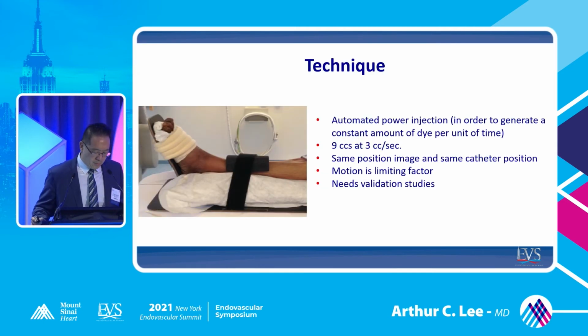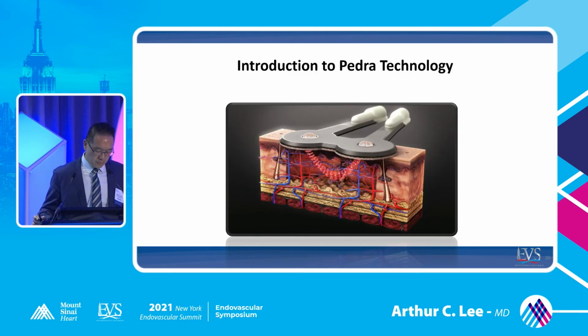And I think the challenges are you have to do the exact same image. So again, the foot cannot move, same injection, same view, et cetera, et cetera. And I think that's the limiting factor. And again, I think there still needs to be some validation of these techniques.